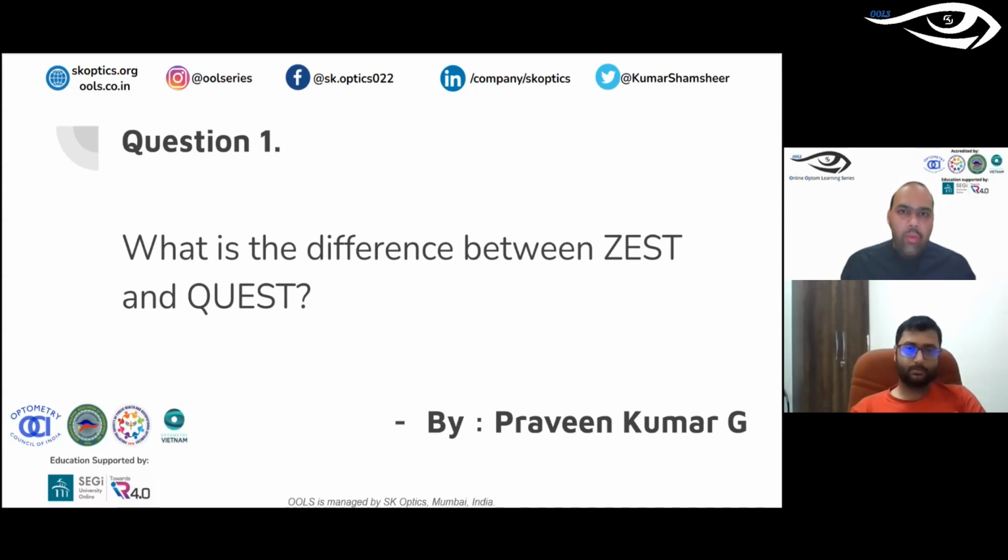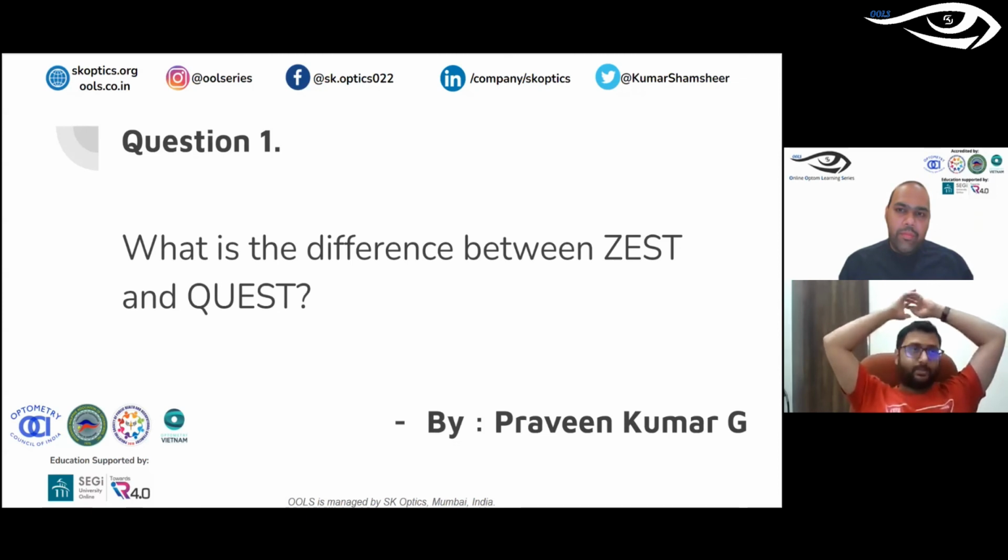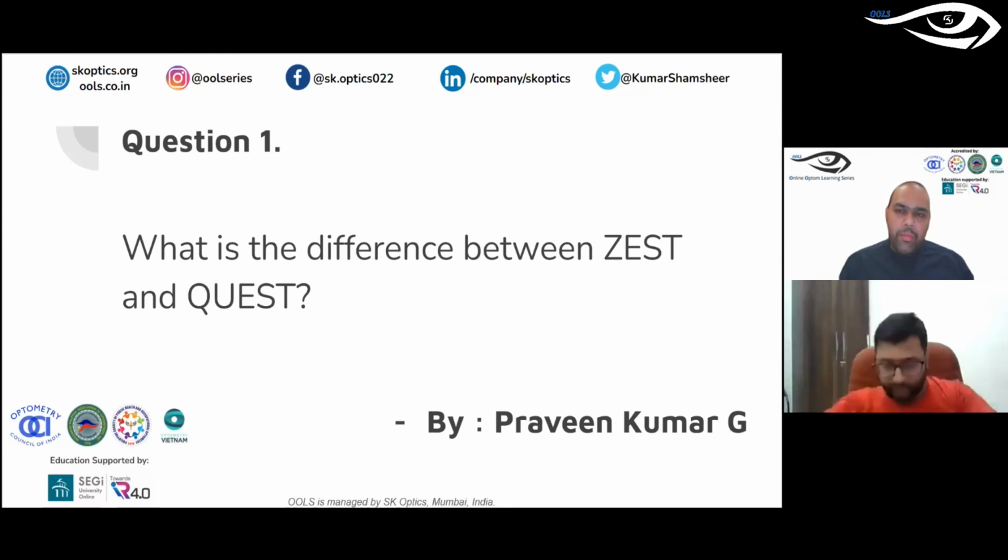Awesome. Great. And one question which popped up is about instructions. When you're doing the testing strategies, you have so many now. We talked about ZEST, QUEST. Are there different instructions to be given to the patient? Absolutely, the instruction matters. There is a fantastic study by Michael Wall back in 2000. I can forward you the paper, but they gave three different instructions. One is very liberal instructions, one is very conservative instructions, and the third is where you do whatever you want.